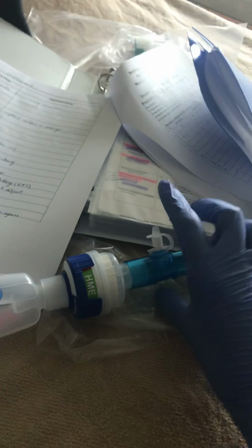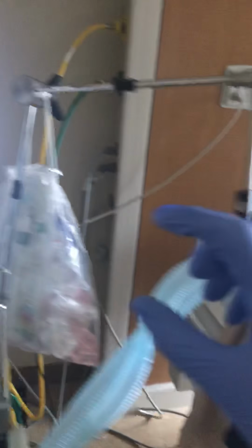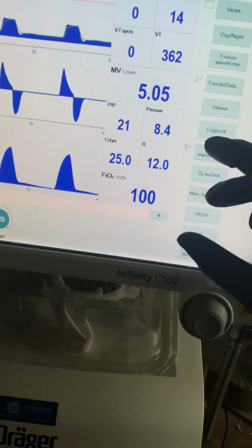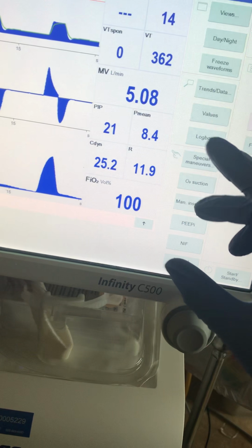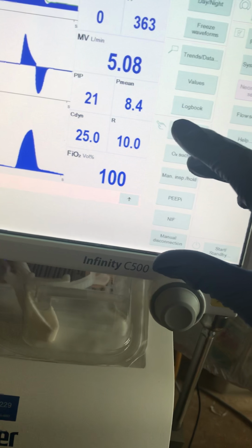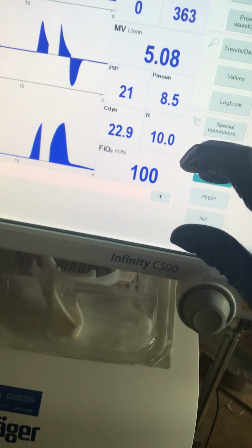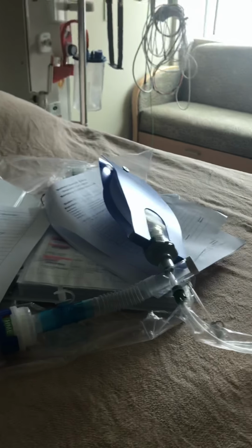Let's say the patient has an at-home Symbicort inhaler that they use, and the doctor would just like to have the same order. So we can take the canister and put it in line here, and the goal is to deliver the medication simultaneously with the breaths that are given, or if you need to, give a breath hold. So we're going to disperse, do a breath hold, and release. Wait 30 seconds, disperse, breath hold. There we go. So we're mimicking what we would do with a normal patient delivering an MDI.